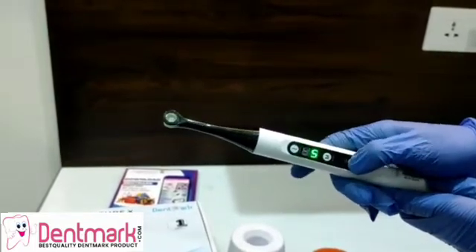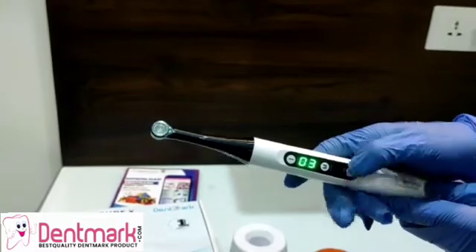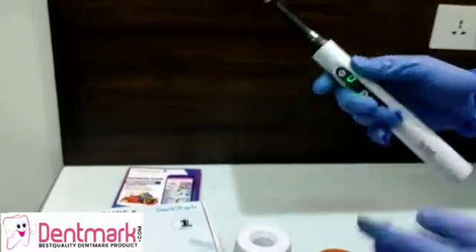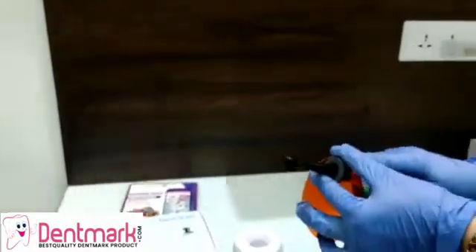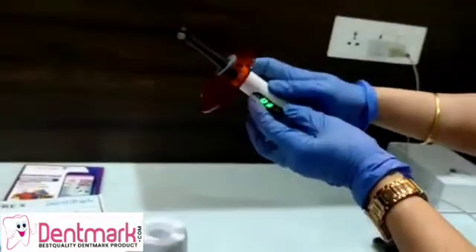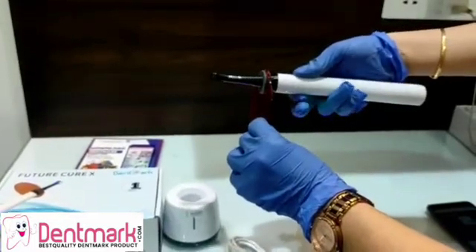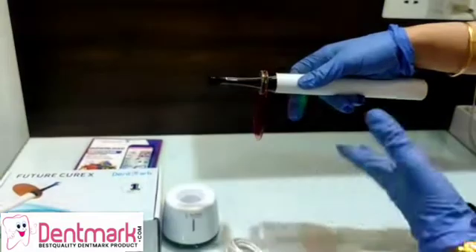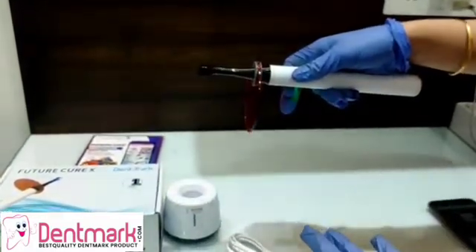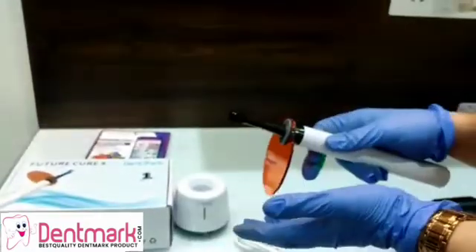Now let's switch this on. Let's set it on power mode one and set the timer to one, two, three. We are going to use the eye shield. Now push the button on — and it is on. So this was the one-second curing light.